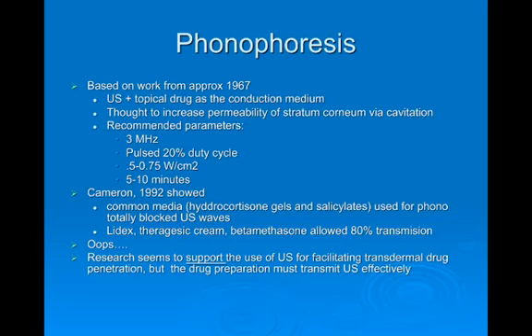All right. So this is pushing drug through the skin by using the ultrasound energy. We're using ultrasound mixed with some sort of topical drug as the conduction medium. And the idea here is that we're increasing permeability of the stratum corneum, and recommended parameters are listed there.